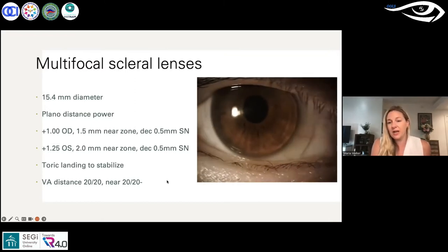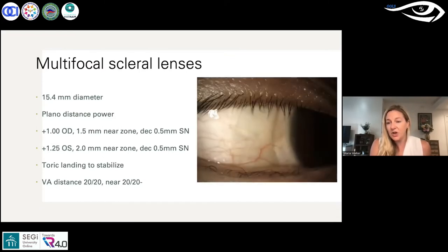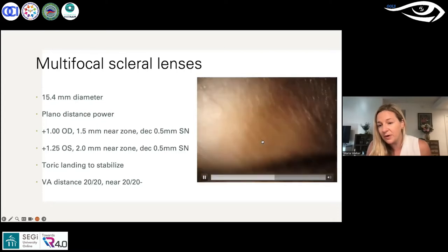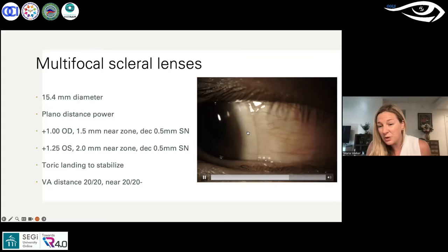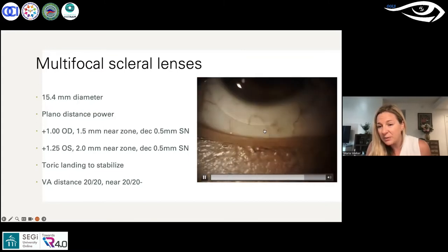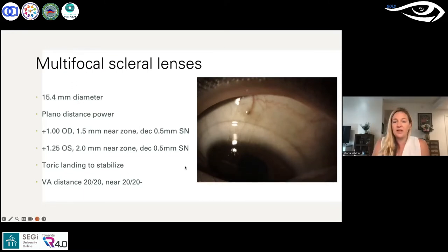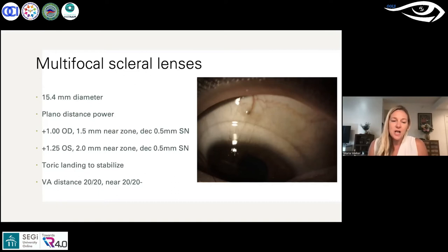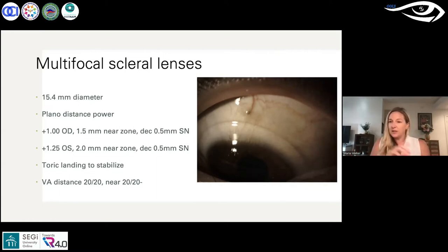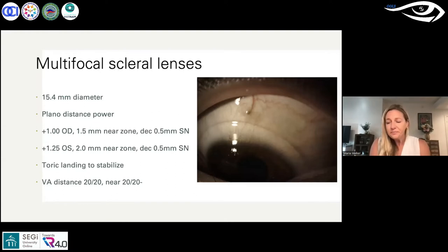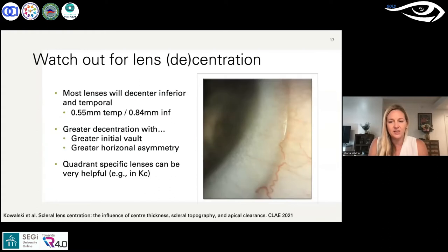Looking at what the lens actually looks like on the eye — it looks kind of like a soft lens. I have them look left, right, up, down, and zoom in on blood vessels, looking for obscuration. The eye looks pretty white and quiet. You can see a nice inferior blood vessel moving through without interruption. You can also see the toric markers. This lens had a toric landing zone — one axis a little flatter, 180 degrees away a little steeper — so the lens stabilizes, benefiting most patients because their sclera is somewhat asymmetric.